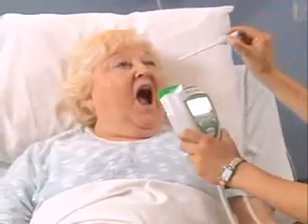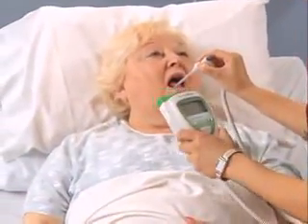Assessing vital signs is an integral part of nursing, and doing it right is important to make sure you have the accurate data for the patient's plan of care. Let's start with temperature. The most common way to take a temperature is orally, but you should avoid the oral site if the patient has had mouth surgery or a disease of the oral cavity.